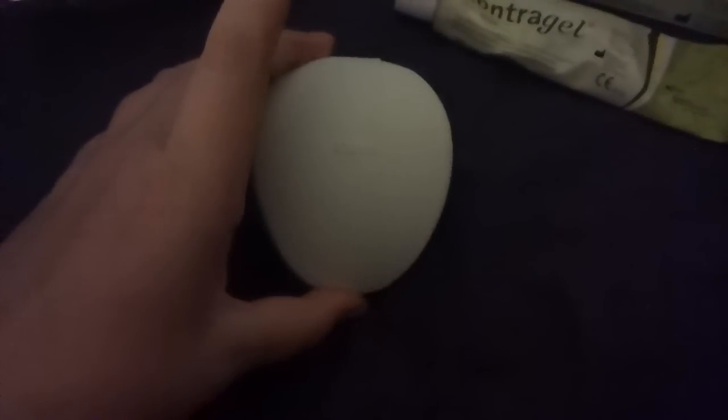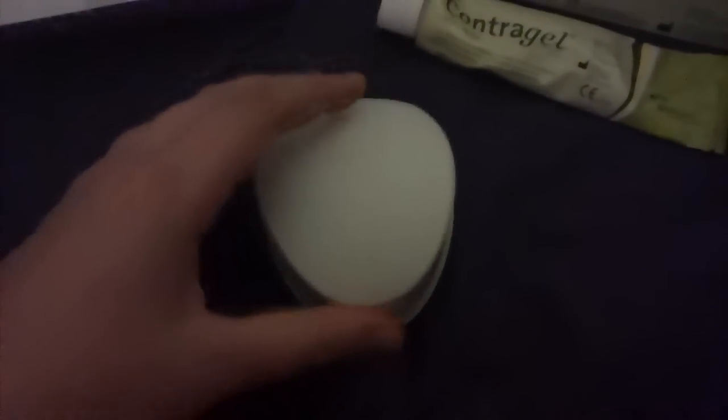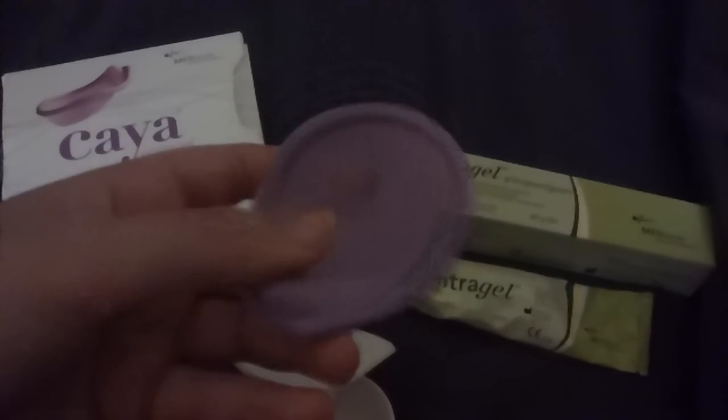Moving on — I didn't think I'd have any problems inserting the Caya because I've been a menstrual cup user for over six years. I'm 23 now and I've been sexually active for many years, so I'm quite familiar with my body.